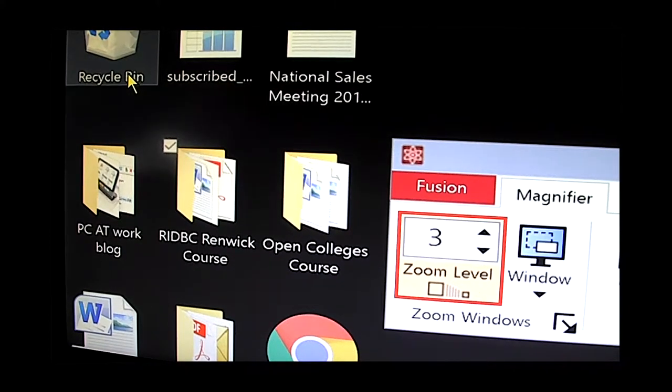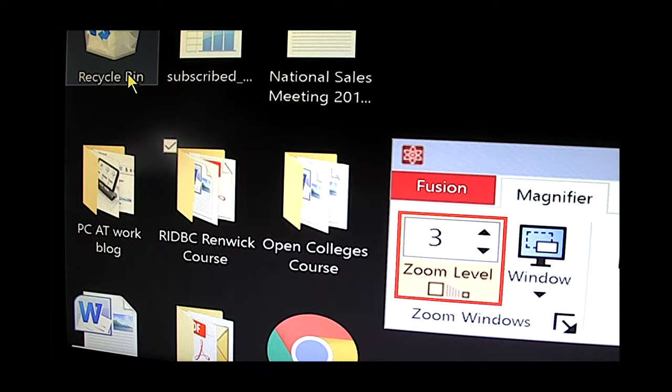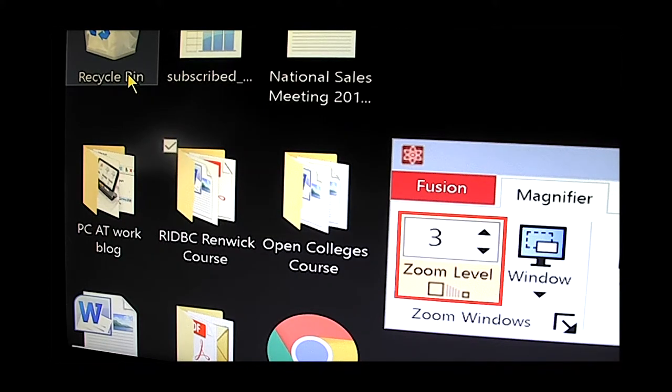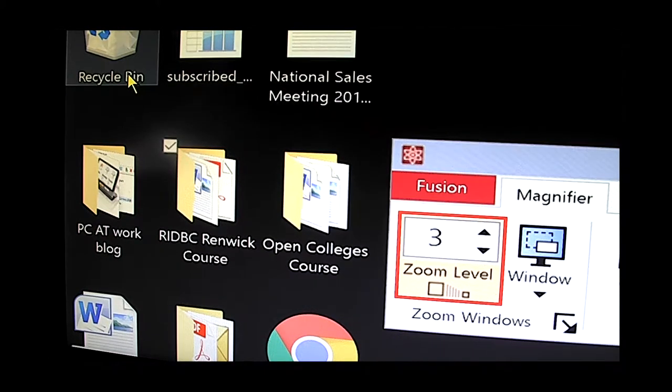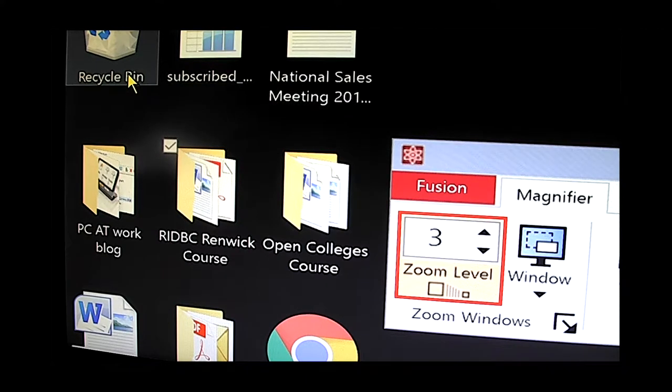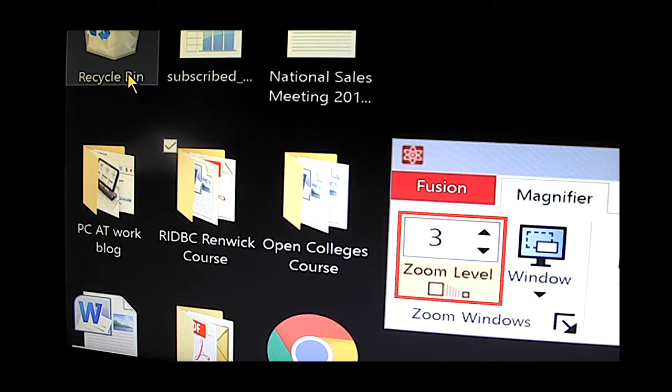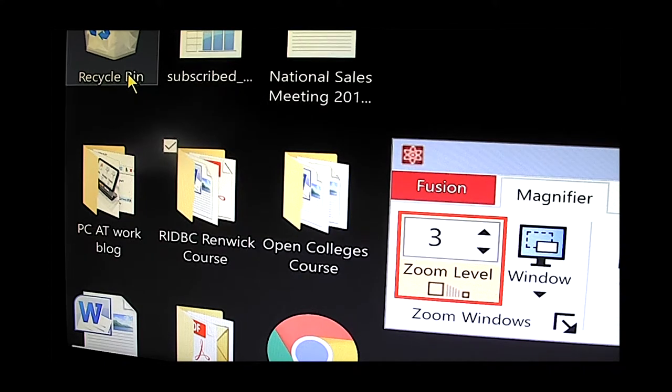And here we are at 2.75 and as we go up to say 3. Now we're seeing just one-ninth of the whole screen because we're at a three times magnification. So if you imagine the screen divided into sections there will be nine rectangles that make up the entire screen.